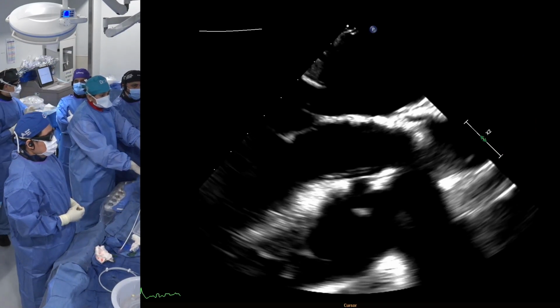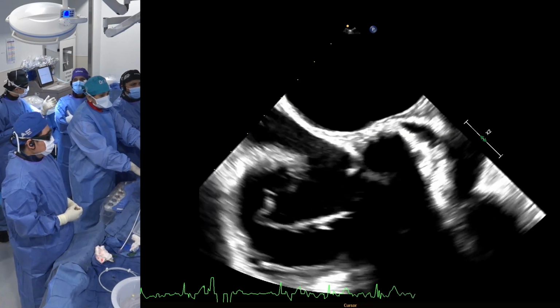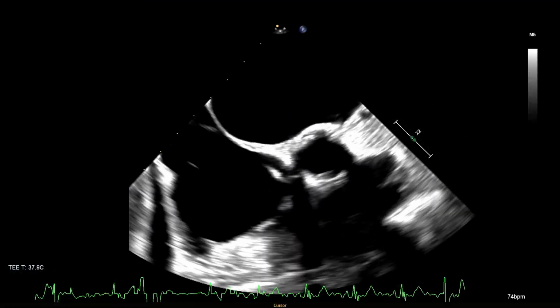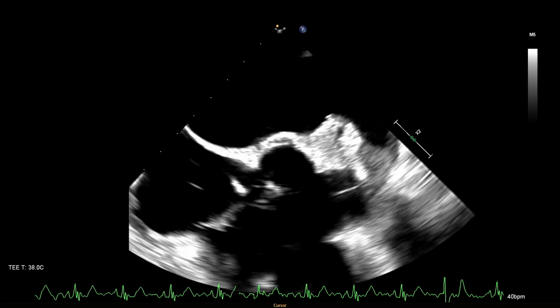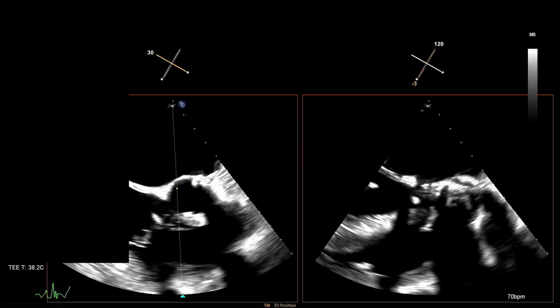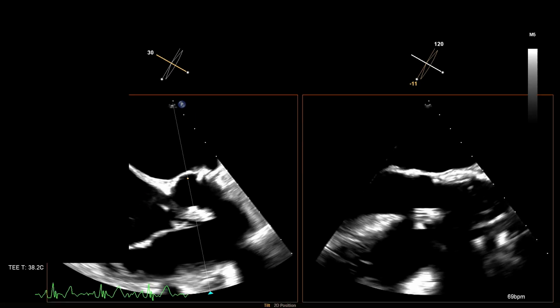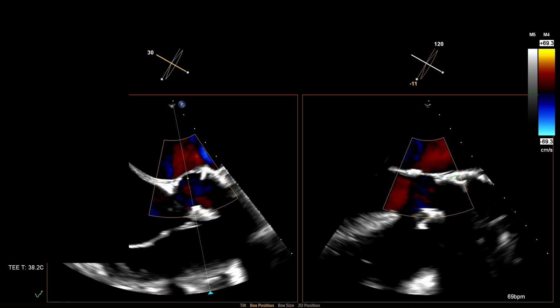One thing we see is that with patients with prosthetic AR, once you deploy the valve, you have a very hard time to pace again because they now have no AR. That's very true. It's hard to get the waveform down. That's why we had to slowly ramp up the pacing to make it work. Looks good, Stam? Yeah, very good. Put some color on, please. Bring the color down.